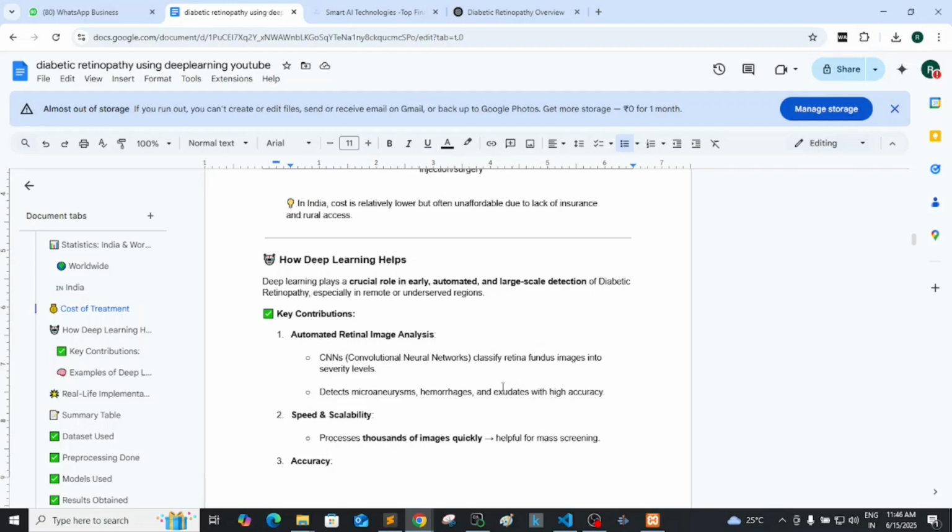And you may say now doctors already can do this. The problem with the doctors is that any human being will have human error. Our brain is limited to some numbers, so above that we can't analyze. For example, you can't analyze 1,000 variations. You can analyze 3 to 4 variations. So we will have a limitation. We can understand the things, but we will have limitations in analysis when it comes to quantity or variations. Whereas deep learning models can understand n number of variations if you train them properly.